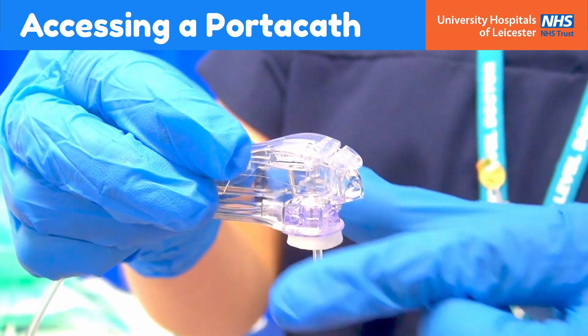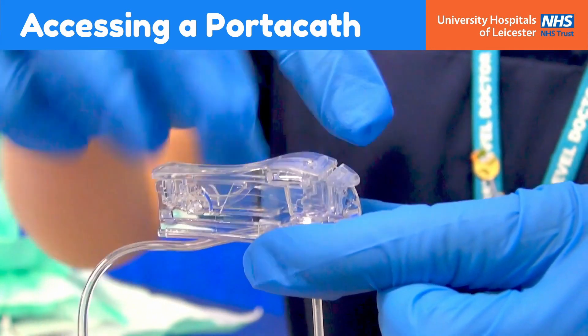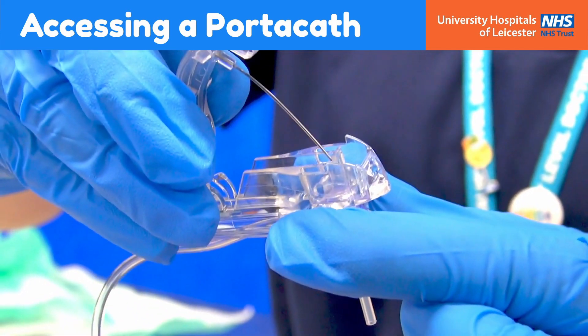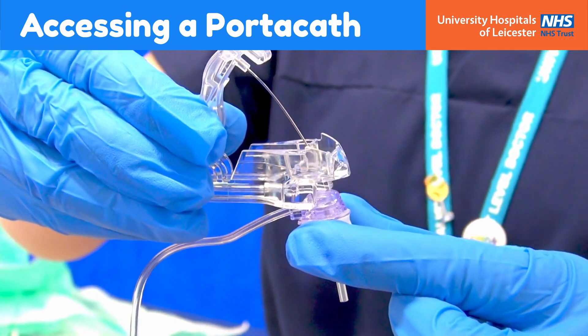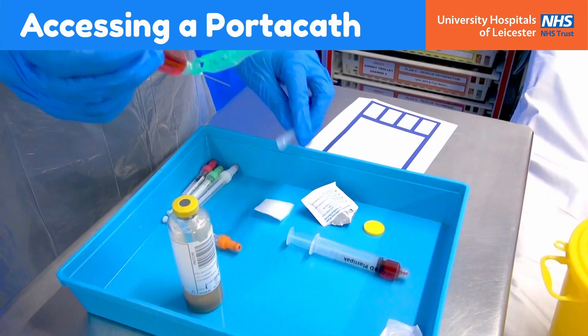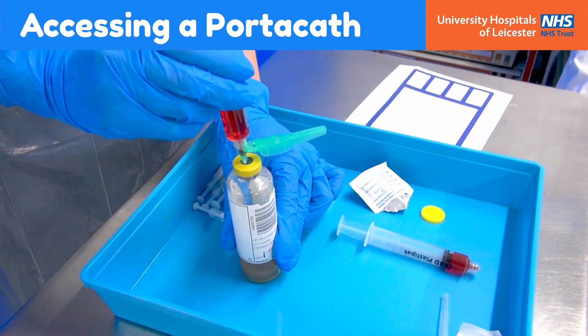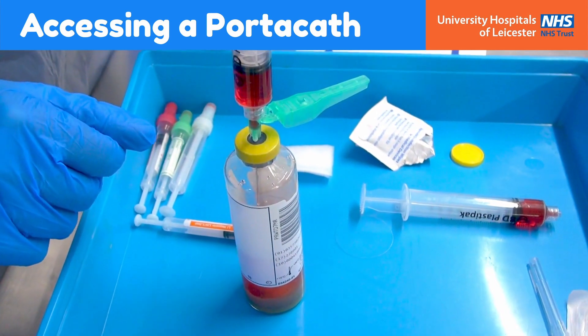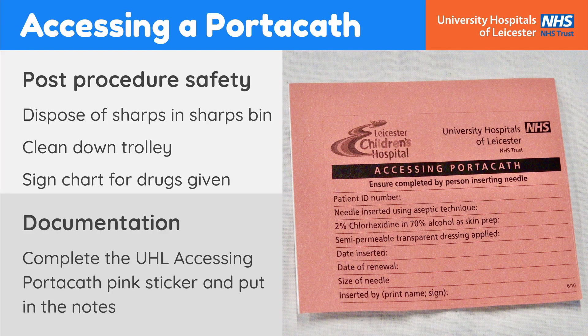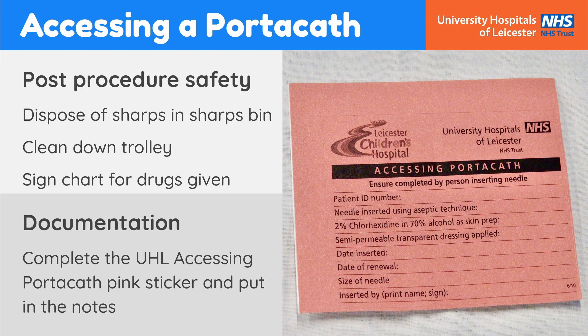Some designs of Huber needles have an inserter with a tab which must be clicked back and the arm lifted to lock the inserter needle into a safe position before disposal. This leaves behind a low profile blunt device in the accessed chamber. Transfer collected samples into the blood bottles and label these by the bedside. After the procedure, ensure sharps are disposed of in the sharps bin, equipment is cleaned down and the administered drugs are signed for on the patient's drug chart. A UHL accessing portacath sticker must be completed and put in the patient's notes.